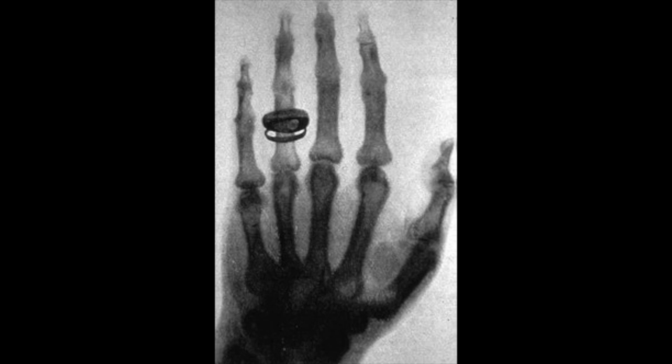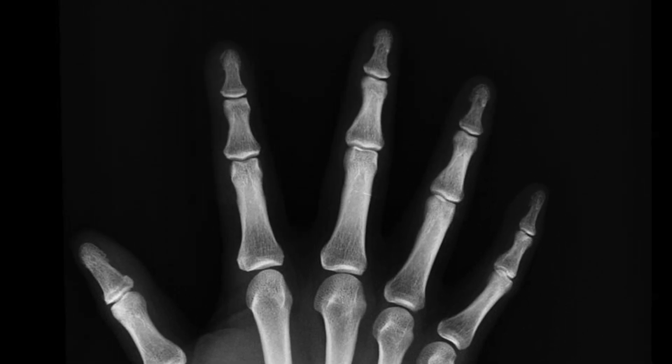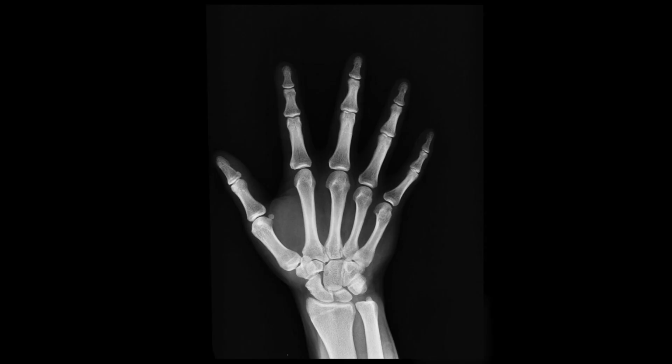The reason is that Röntgen developed this image from the negative he initially created. Essentially, he did what many of us would have done because it would have seemed natural. He made a photograph out of the negative. Today, X-ray negatives are not usually developed into photographs, and what you see are the negatives, such as this one.